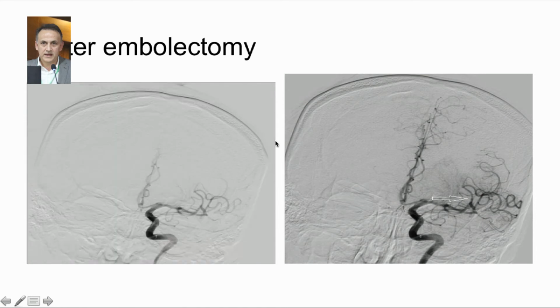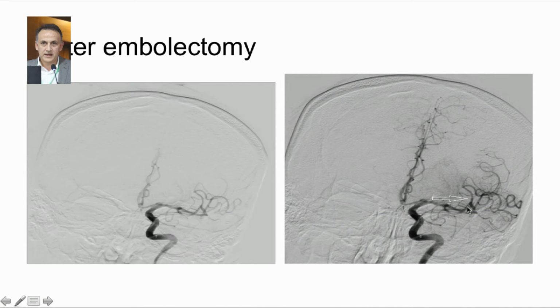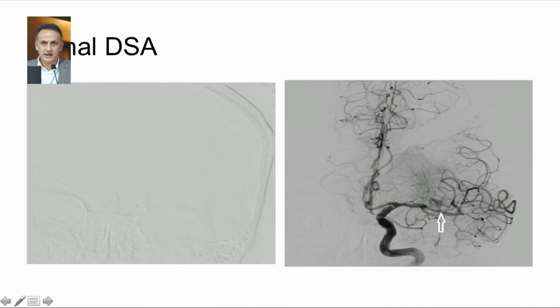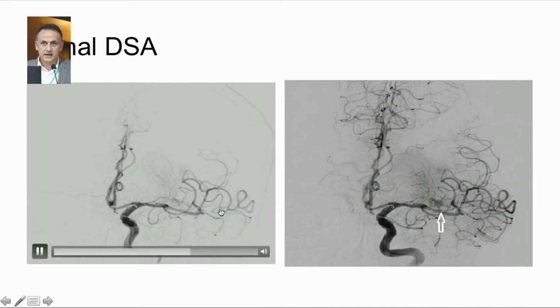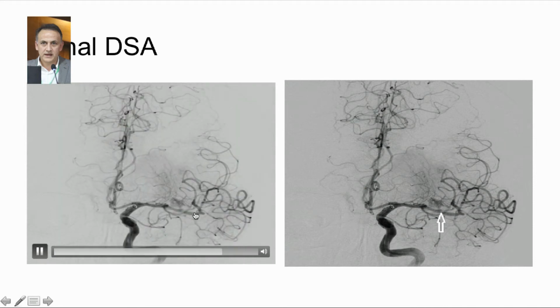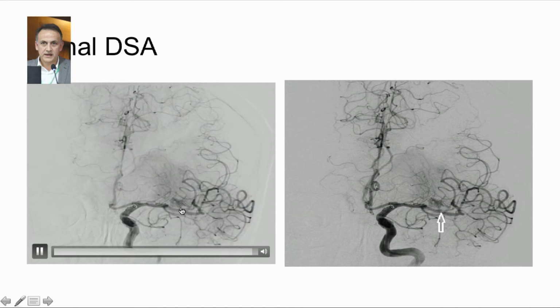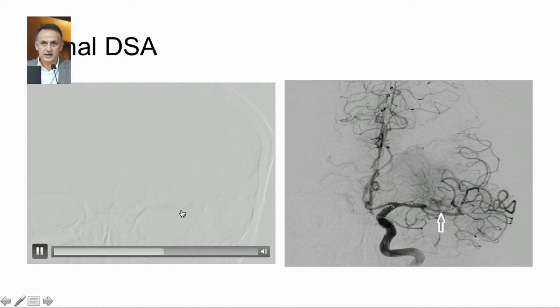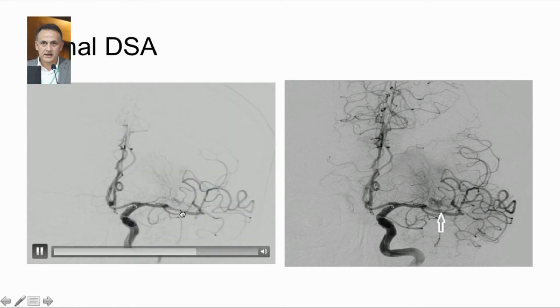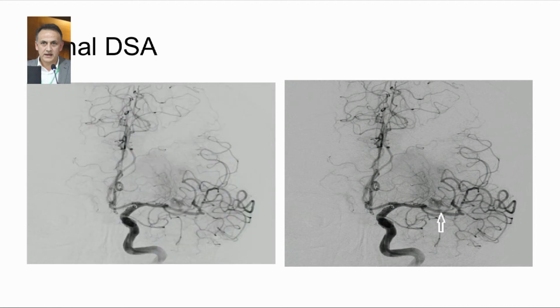And after embolectomy, the flow is not good, but after that, what we have seen is, please look carefully, we have a small perforation here. We have to be very careful about perforation. The cerebral artery has a very thin wall, not like the coronary artery, and they are almost in fluid.